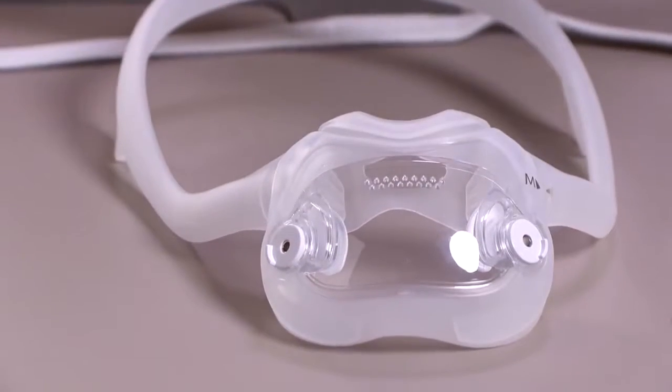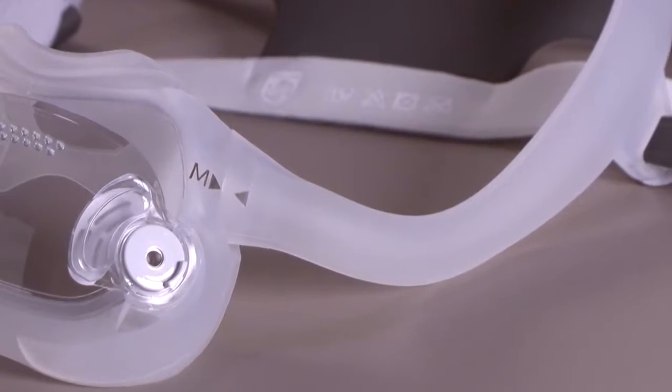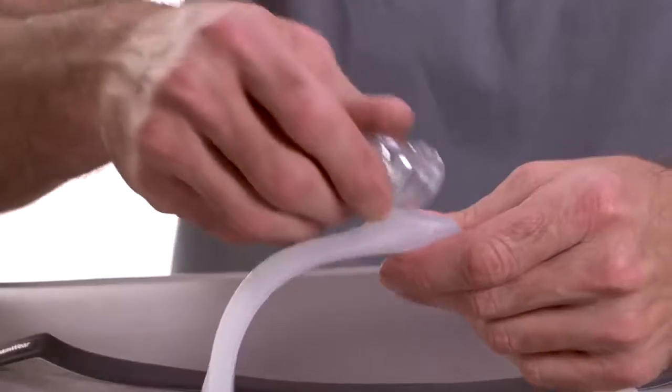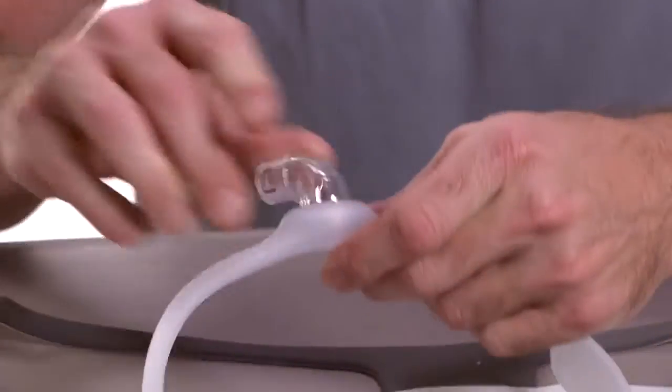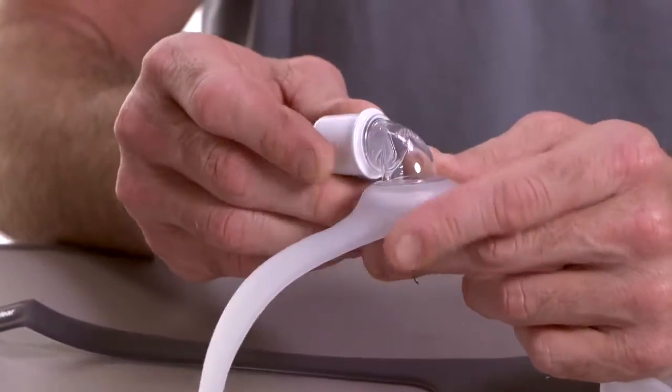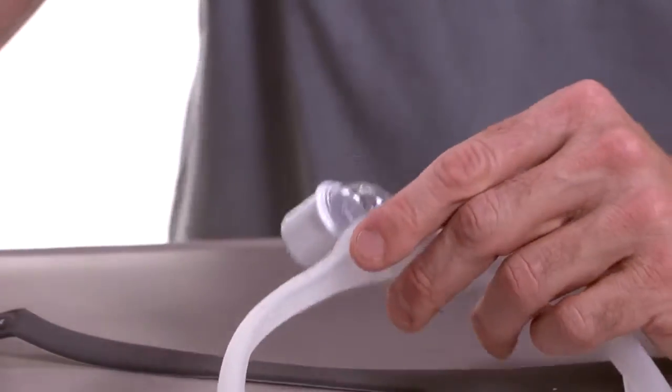You should hear it click into place, and the arrow on the cushion should align with the arrow on the mask frame. Insert the elbow into the top of the mask frame. Push the tubing quick release onto the elbow — once again, you should hear it click into place.